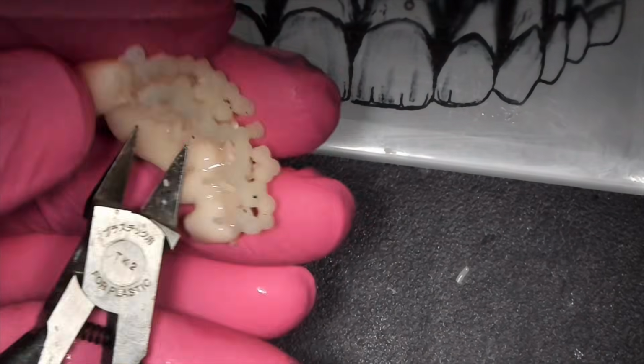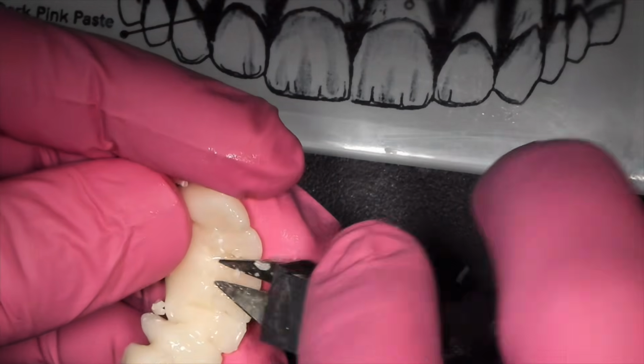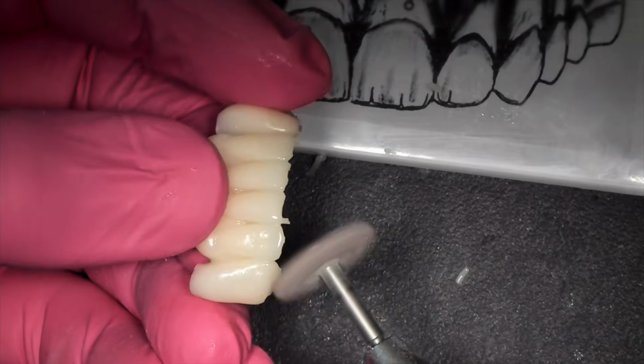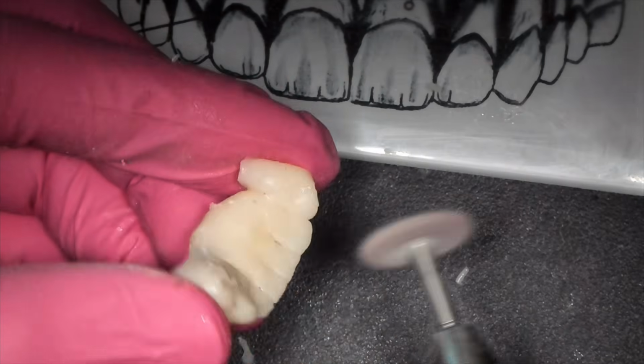So here I am just finishing these things. I'm just snipping the supports with some flush cutters. And I'm going to go ahead and use a rotary instrument soft pad to get rid of those support bumps without destroying my anatomy and the surfaces. So that was super fast. Obviously this is sped up, but that was literally about 10 to 15 seconds to do all that.